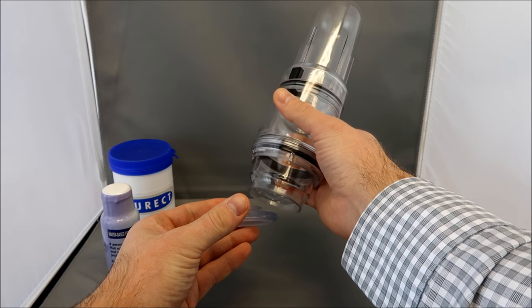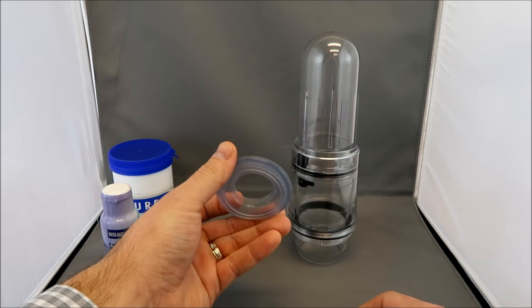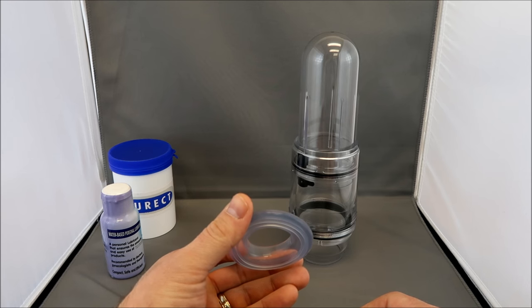Remove the cylinder, leaving the tension system at the base of the penis to maintain the erection.